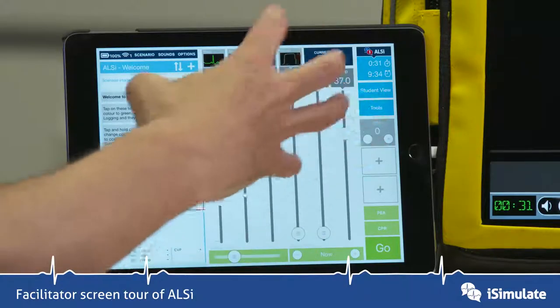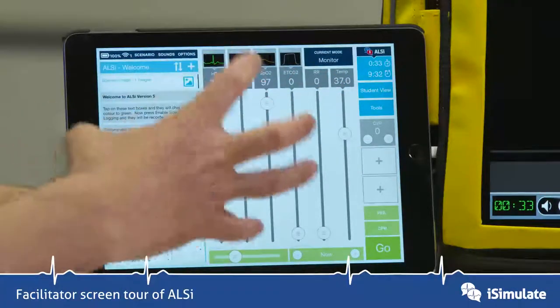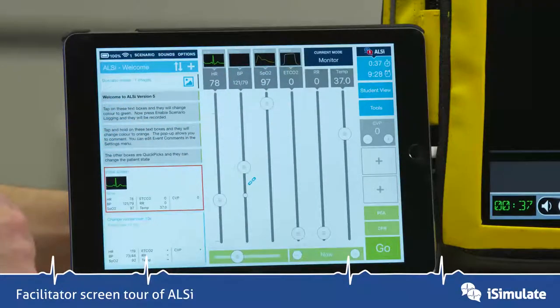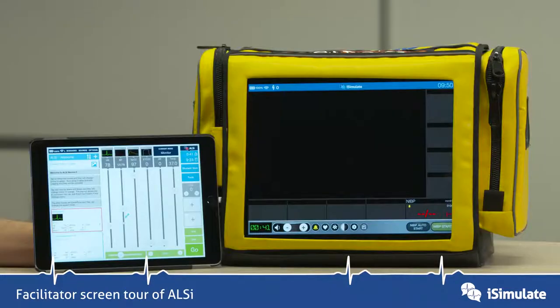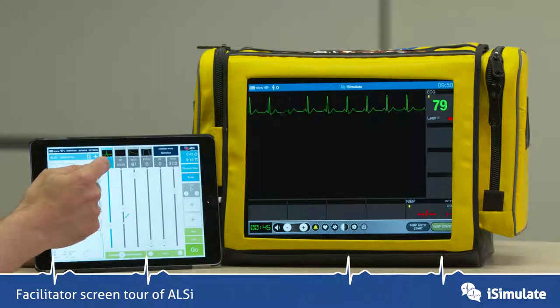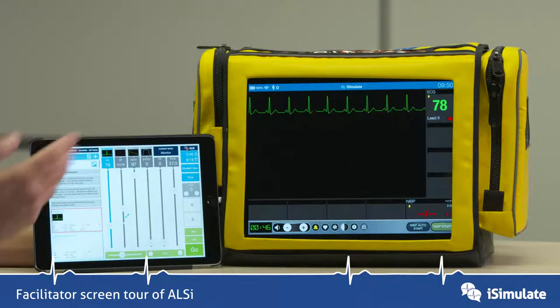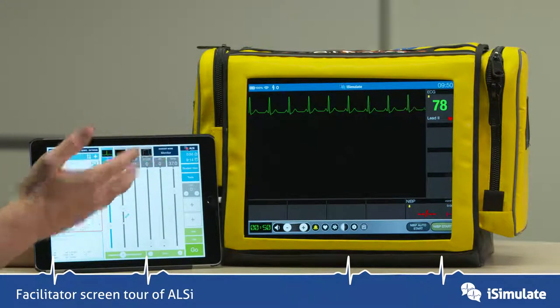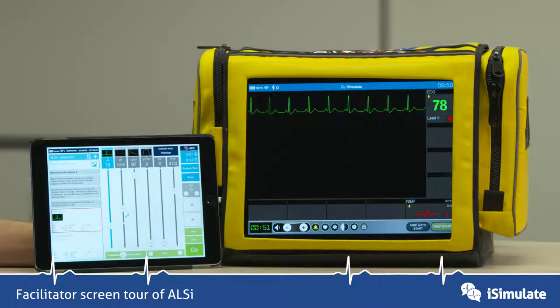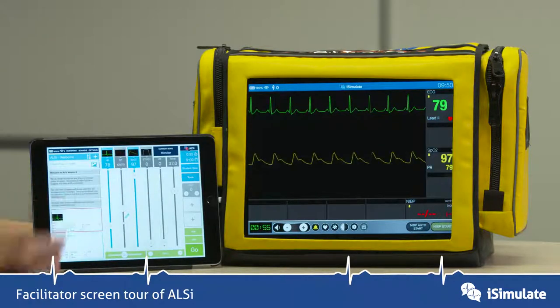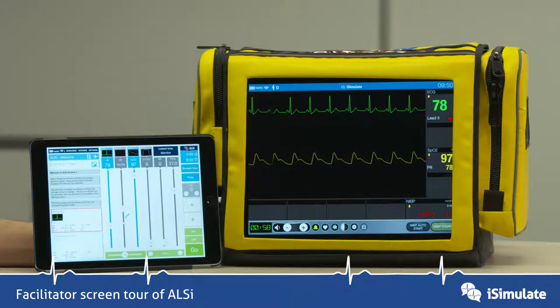If we look at the central part of the screen there are lots of sliders here, and this is how you can control things on the fly. By tapping on one of these grey boxes you can make things appear on the screen. For instance, I've just put the ECG trace on, and by tapping on another one such as SpO2 I can make the saturation trace come on.